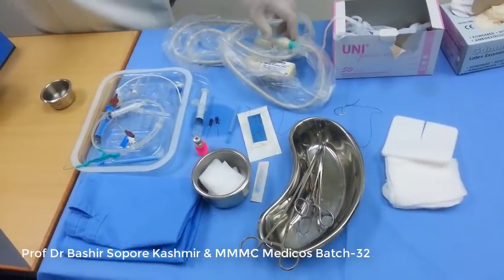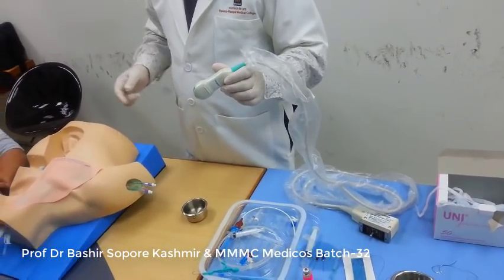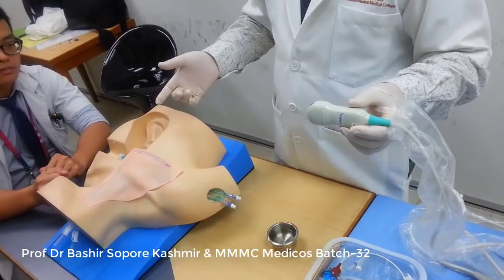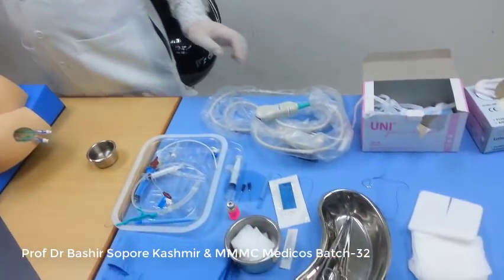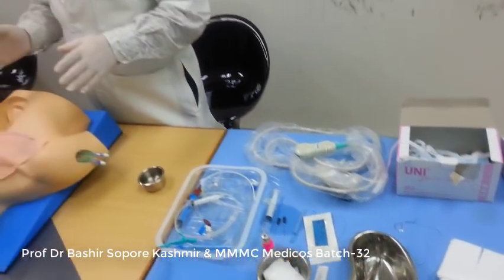We also have the ultrasound probe, so if we have to do ultrasound guided catheterization, we can do it. You got my point? Now I forgot to tell you why we choose this vein, when I was talking to you first.